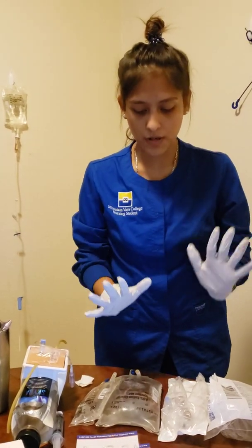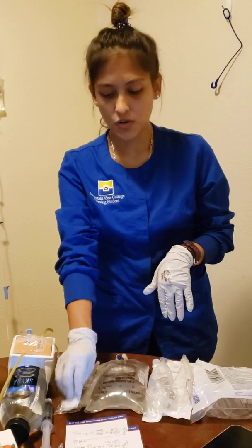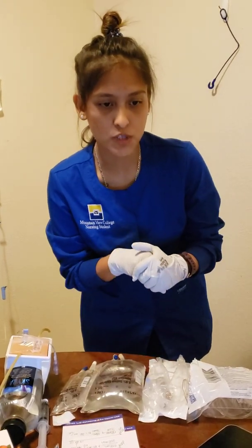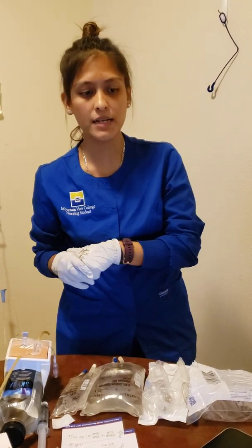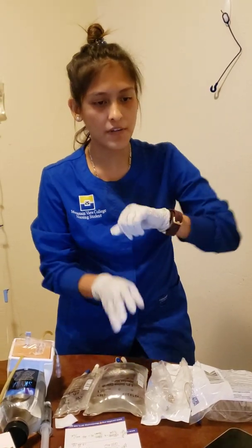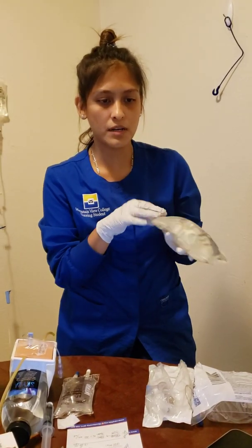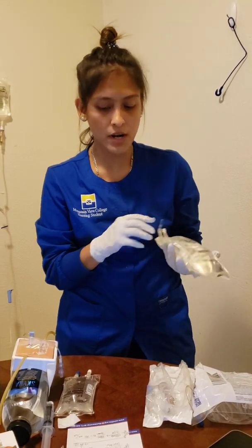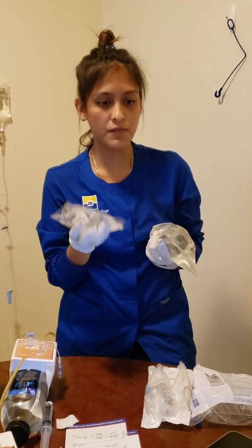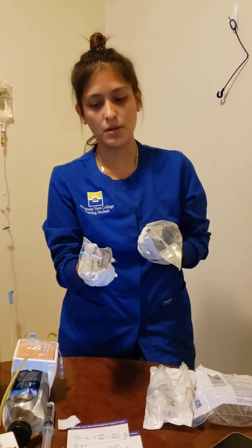So I'm going to go ahead and do my second drug check. I pulled up her chart. Again, this is for Miss Wanda Chi, 9/20/19XX. I have already verified her ID band. And this is for 8 o'clock, 500 ml of sodium chloride, and I have it here. I'm going to infuse this over 10 hours, which is going to be 50 ml per hour. And I have my 8 o'clock ampicillin, 500 mg, which is 100 ml that I'm going to give within 30 minutes.